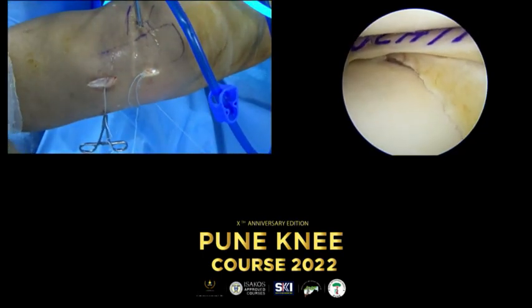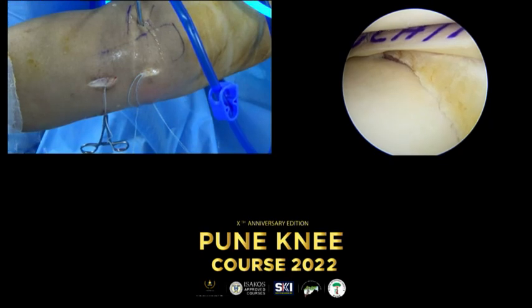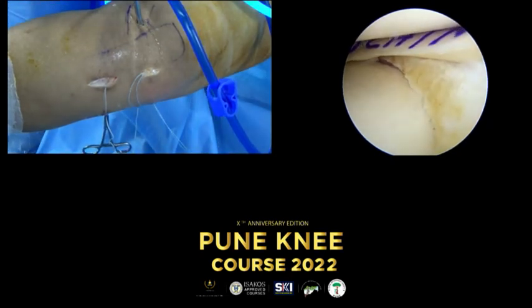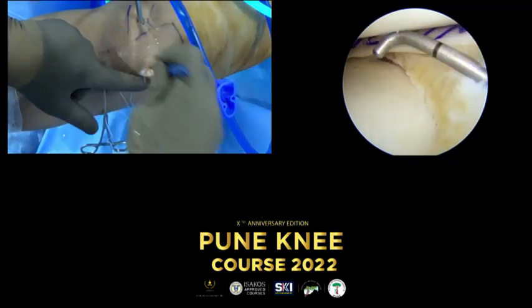I also would like to have a spinal needle and the probe. So I will put it a little bit lower here.